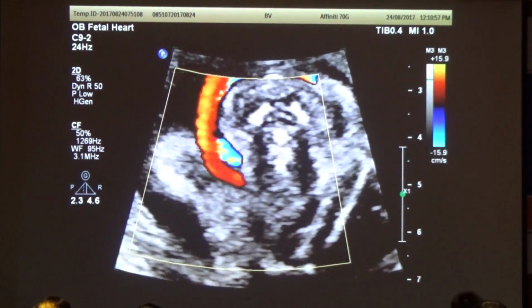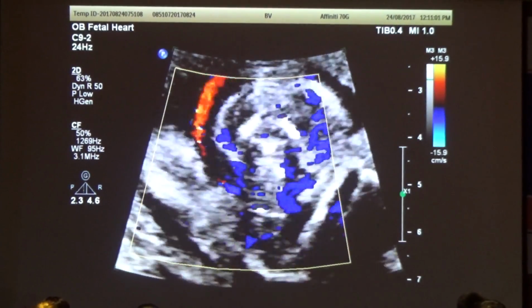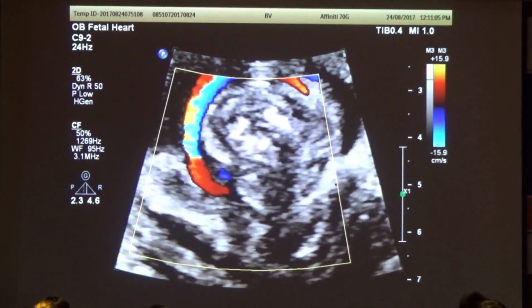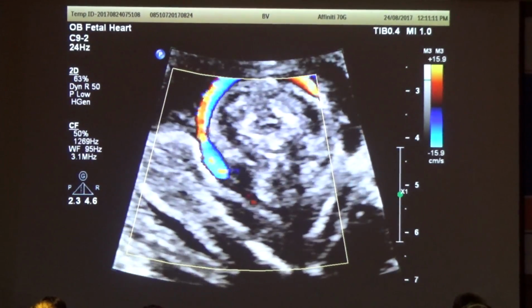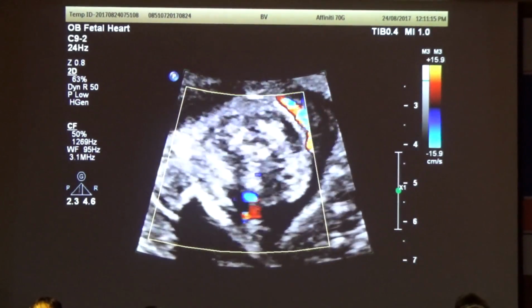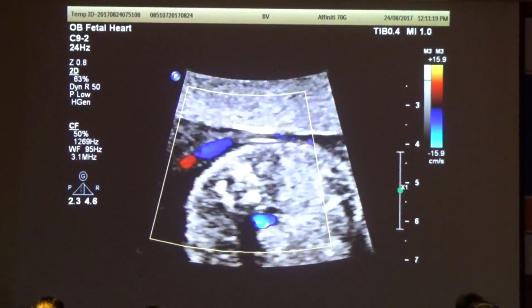Okay, so now I don't want to zoom, but I want to get the depth a little down. Where's the depth control on this machine? Cho cái depth cao nha. Smaller. Cho nó nhỏ hơn nè. Depth. Is there a label that says depth there?